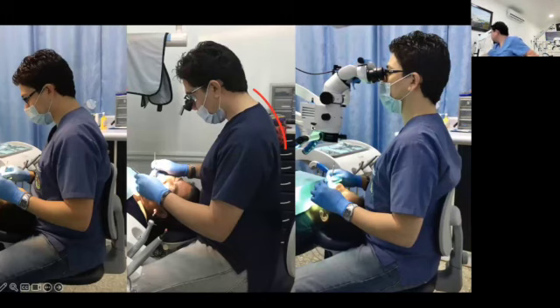And we can analyze something interesting in this picture, because before working with microscope, I started working with loops. But if you analyze the position of my neck, those loops were killing my neck. The position was even better without using the loops. If you are going to use loops, it's important to have personalized loops, and even better if the loops are angulated. If the loops are prismatic loops and they have the lenses in an angulated tube, you won't have this problem with the neck. With the loops, I was seeing better, but I started feeling pain in my neck, because these loops were not personalized. They were just very cheap and regular loops by that time.